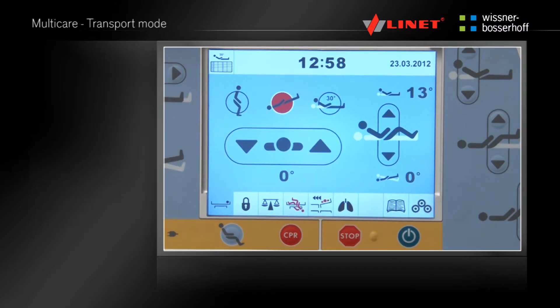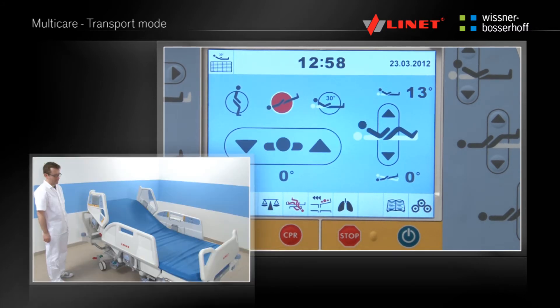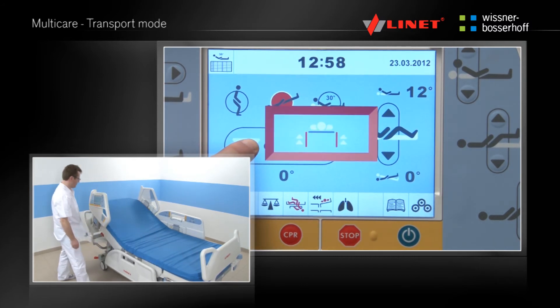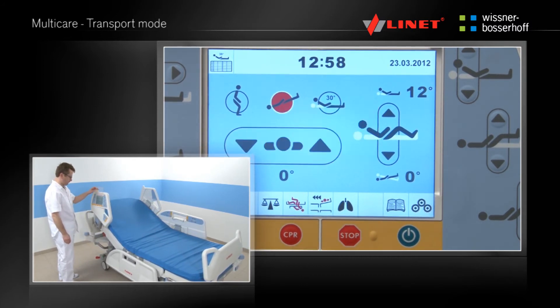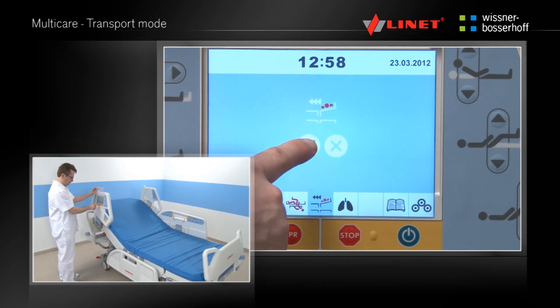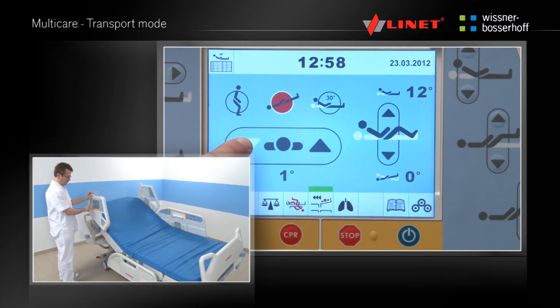Press the Activation Go button. By pressing the respective button the transport mode menu can be accessed. Under normal circumstances if the side rail is folded down the lateral tilt on the respective side will be disabled for safety reasons. This safety feature can be deactivated for 3 minutes in the transport mode.